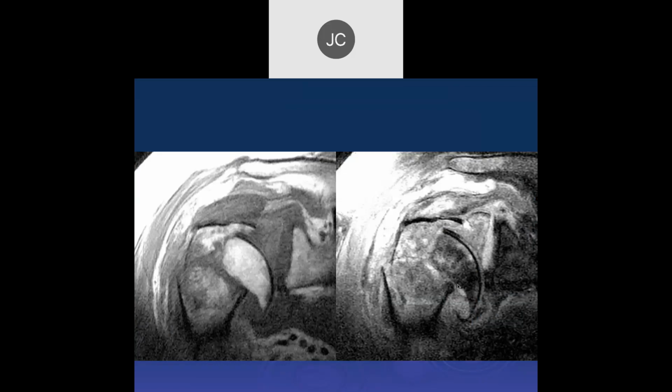Okay, so here we see a fracture of the humeral head. I see two fragments. Yeah, probably 1, 2, 3. Oh, okay. And then there's a lot of displacement here. There's rotation, and it's involving the humeral articular surface here.